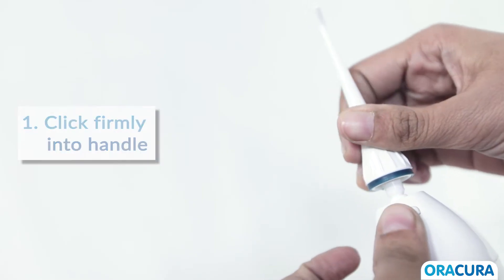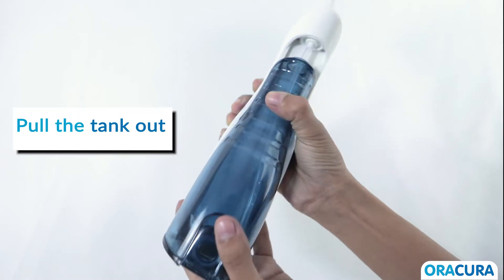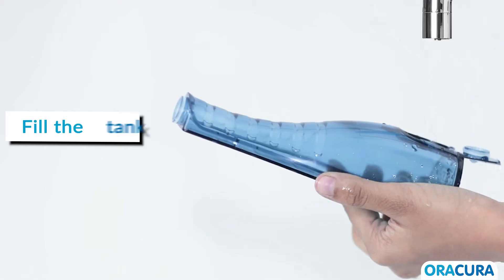Step 1: Attach the 360-degree nozzle onto the unit. Step 2: Open the water tank cap, or you can slide the water tank down off the unit, and fill the tank with water.